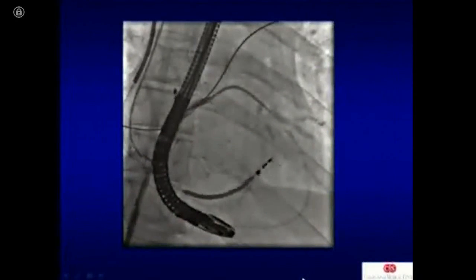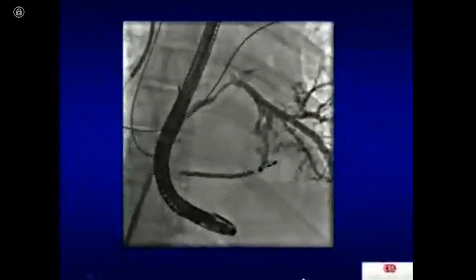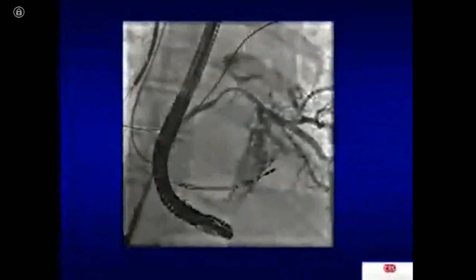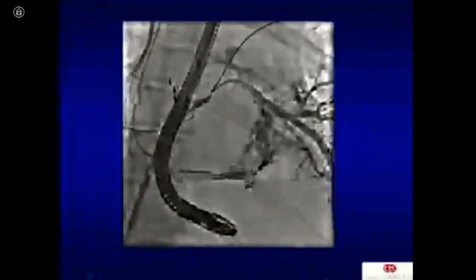And then I just decided to do an angiogram and say, wait a second, and this is what you can see. Oh, yeah. Oh, my God. So you can see what the thing is. Now, I thought of this, but I never even thought it would happen because I said, look, it's in the pulmonary vein. Why should the pulmonary vein communicate with the pericardium?